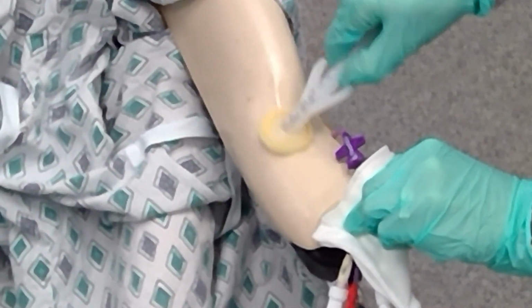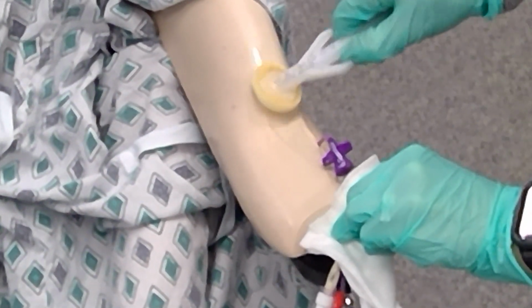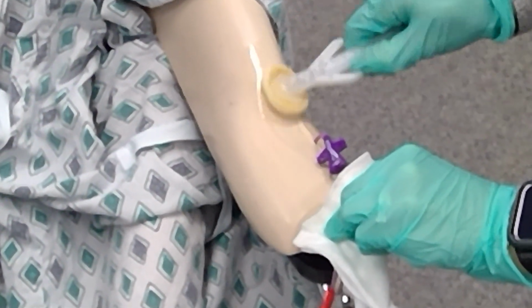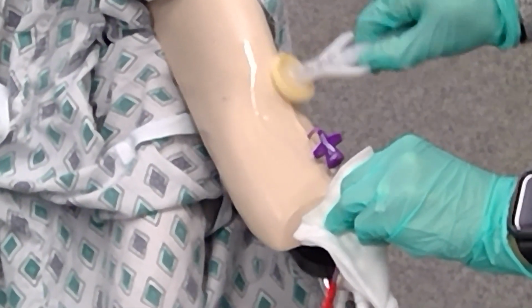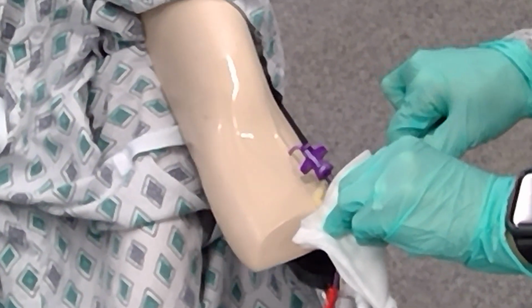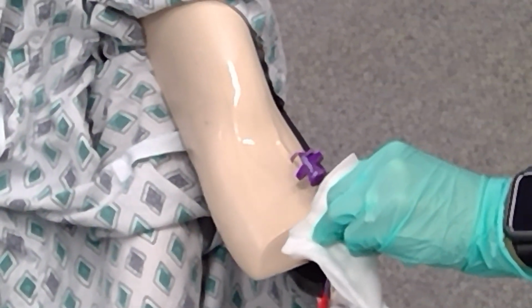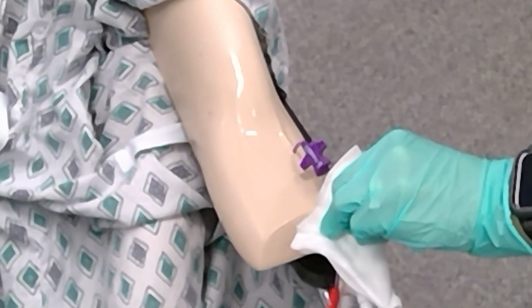Seconds there, and then you can go out. Now I want you to think about all the area that's going to be underneath that dressing. We want to make sure we clean all that area. Okay, so 30 seconds there, and then you're done. And I'm going to throw this in the trash.